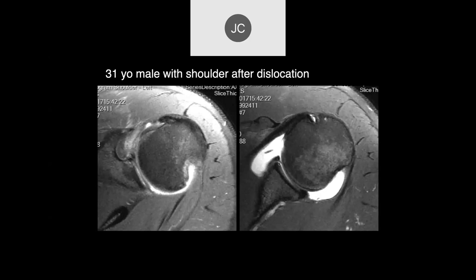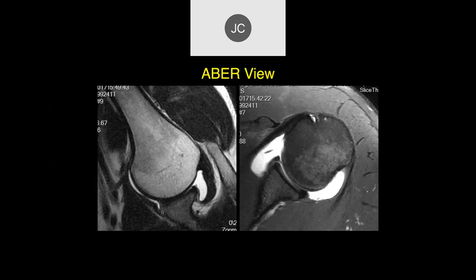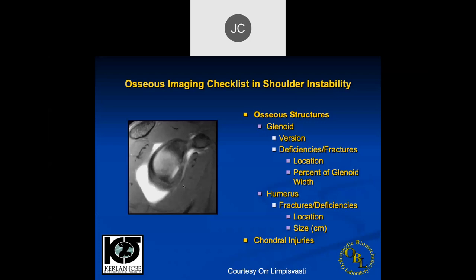On more superior images there is a Hill-Sachs defect — kind of V-shaped, classic, with a little edema, so relatively acute or subacute. On the ABER view we can see a tear of the anterior inferior labrum — this little thing here shows a tear, but the periosteal attachments are still intact. The ABER view can occasionally help, but after a first-time dislocation many patients won't let you put the shoulder in that position.